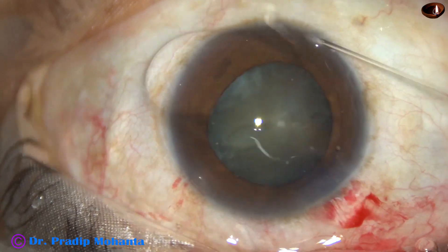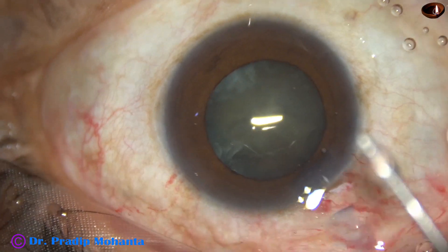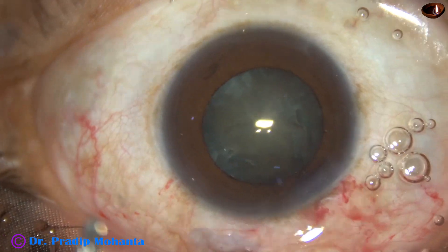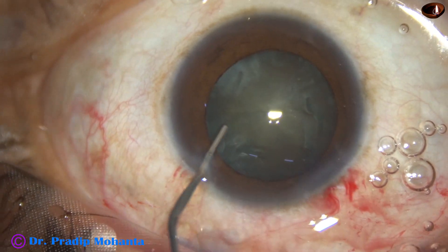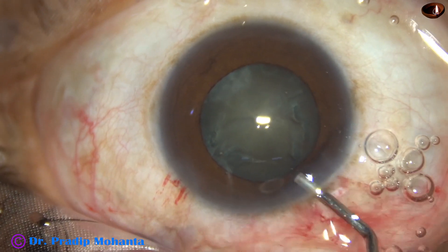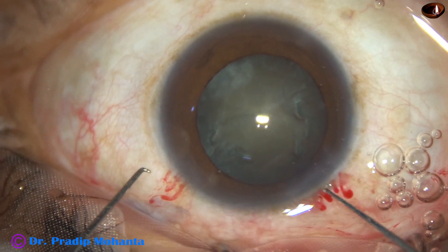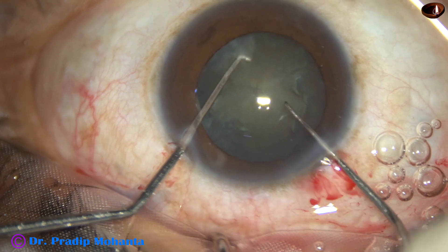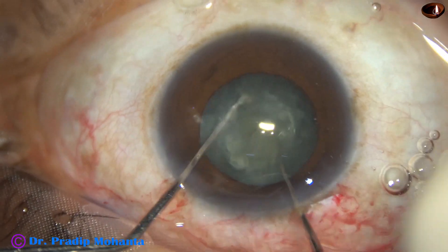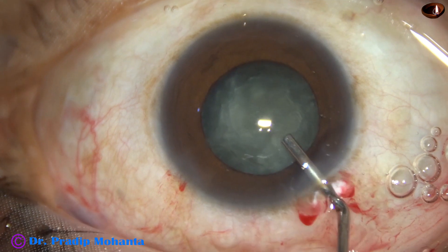Hydrodissection is done with BSS and this 27-gauge cannula. The lens mass is separated from the remaining capsule. The nucleus is mobilized and then viscoelastic substance is injected again. Now is the time to rotate the nucleus. I am using the nucleus bimanually, using two hooks, so that it gets separated from the capsule entirely. Visco is injected again.